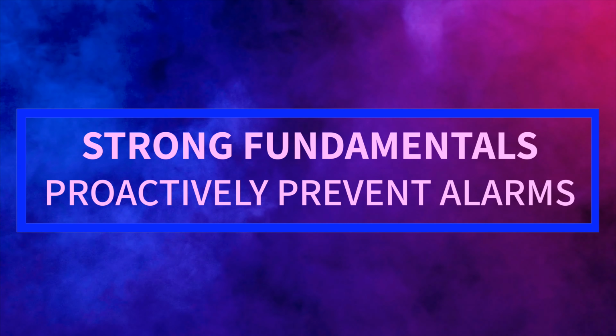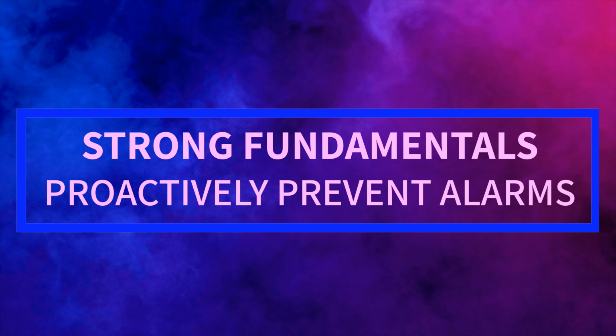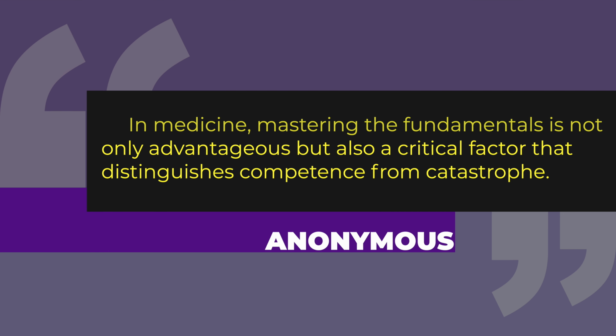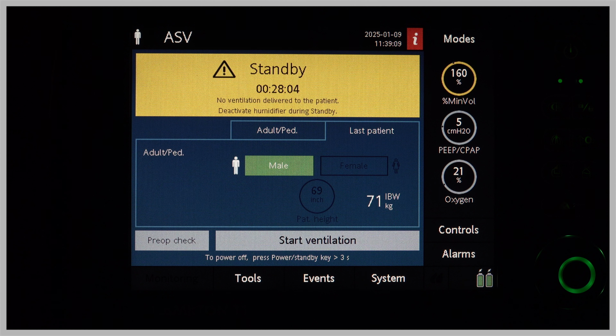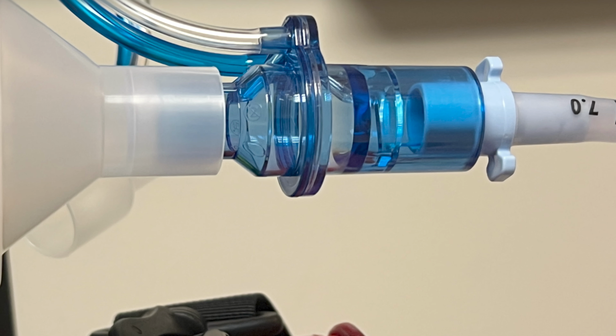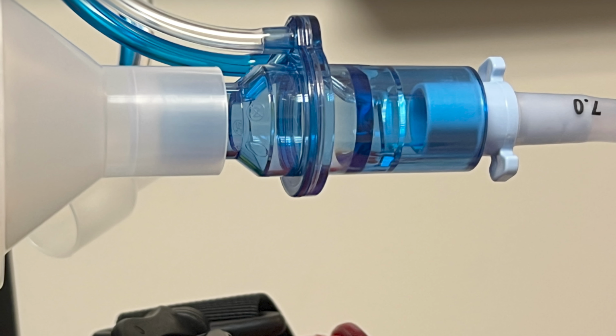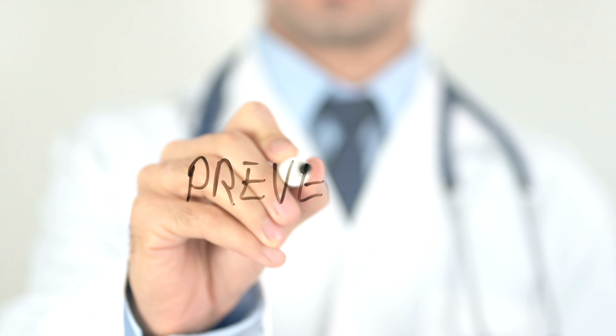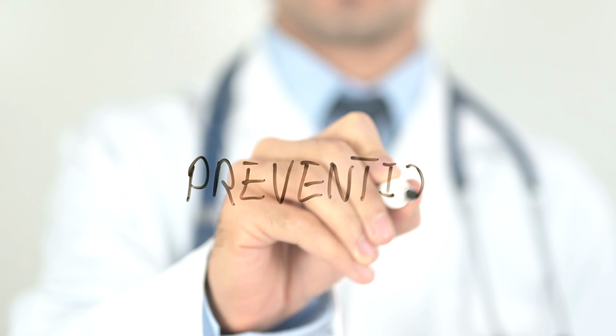A crucial note about strong fundamentals. In medicine, mastering the fundamentals is not only advantageous, but also a critical factor that distinguishes competence from catastrophe. Consistency is key. Verify preoperative checks and circuit connections, and tighten all fittings, including the flow sensor and green high-pressure hose. Remember, preventing issues is invariably more effective than addressing them once they arise.